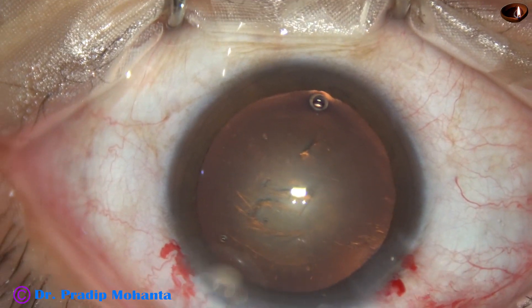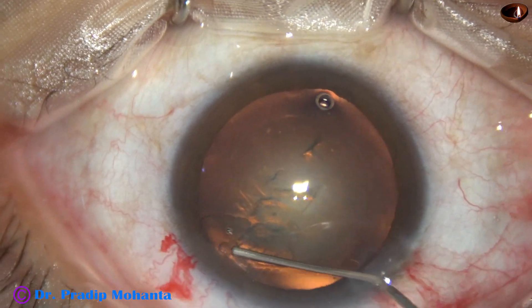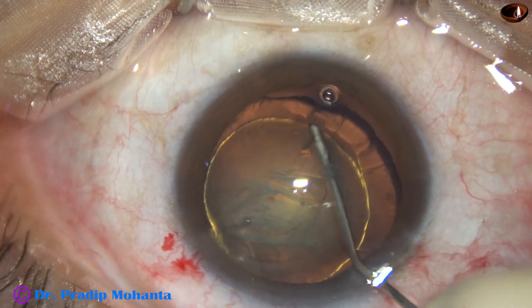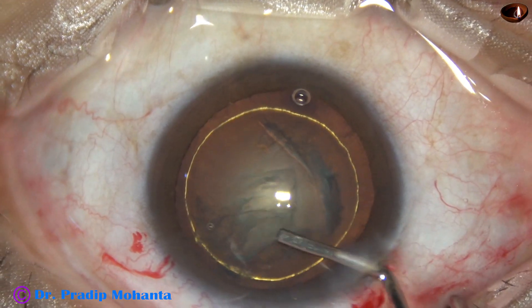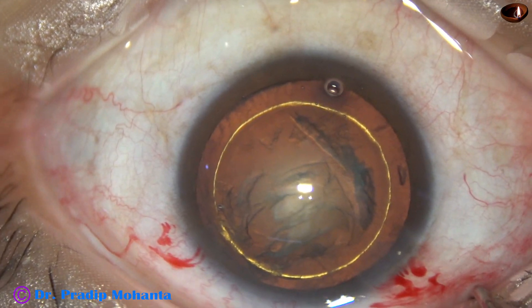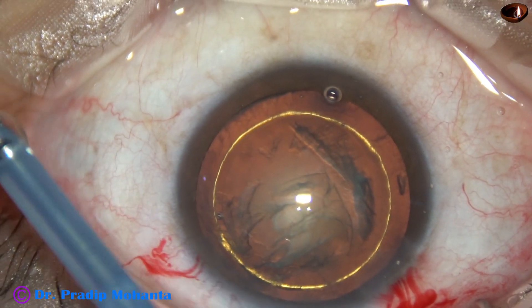And now hydrodissection is done with a 27-gauge cannula. Hydro-delineation is also done. Hydro-delineation has produced a beautiful golden ring in this case. After observing this golden ring, I thought of doing the carousel technique in this case.